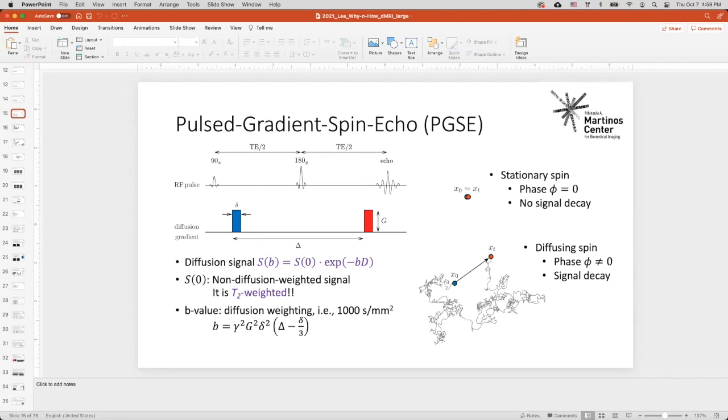And another way is to do post-processing. So for the post-processing, the first thing we can do is denoising, of course. So far we apply denoising on coil-combined images, but actually we can do denoising in complex data at the coil level. So we can have more data redundancy to denoise, because we said we need more than 30 images to do denoising. But if we have a 64-channel head coil, we have 40 coil images, 60 coil images, for example, we have more data redundancy to denoise the image. So we can further bring down the Rician noise floor at the same time.